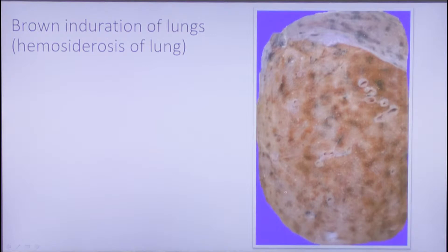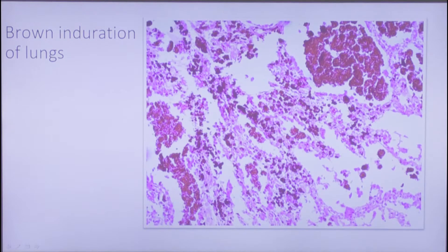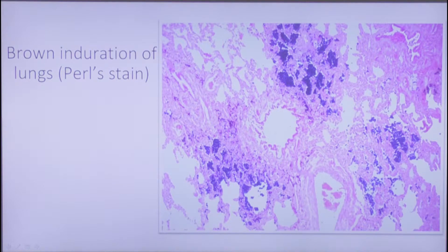This next picture shows a surely pathological condition: brown induration of the lungs. It happens due to chronic venous congestion in the small circle of blood circulation. Macroscopically, the lung would be more dense and brownish. Microscopically, we see alveoli that are more sclerotic and fibrotic, with accumulation of hemosiderin from breakdown of red blood cells that remain too long due to congestion. Here is the same process using a special pearl stain that colors iron in blue, as iron is present here due to hemosiderin accumulation.